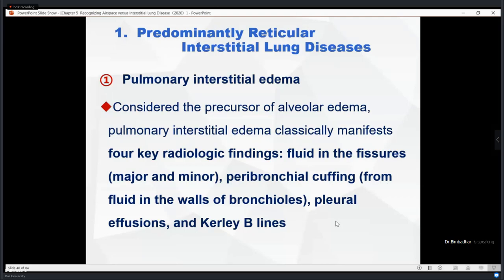So moderate grade or grade 2 hypertension people will generally present with interstitial edema. Long-standing patients with grade 3 hypertension and a chronic presentation will usually come with fluid present within the alveoli. Now, who will have more respiratory distress? Is it the interstitial edema patient or the alveolar edema patient who will have the most distress?